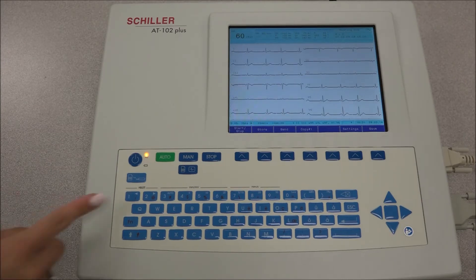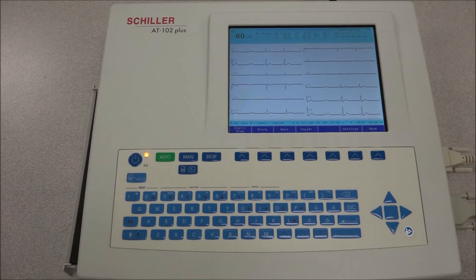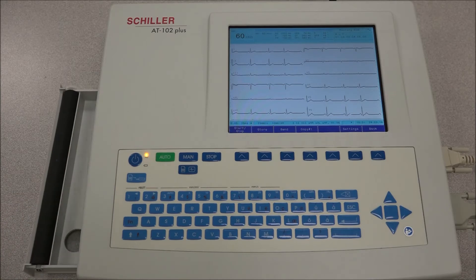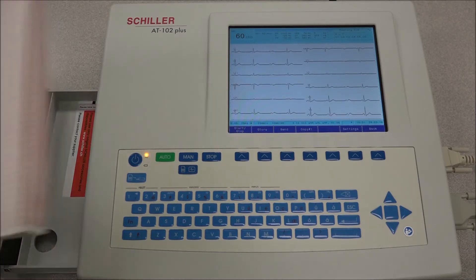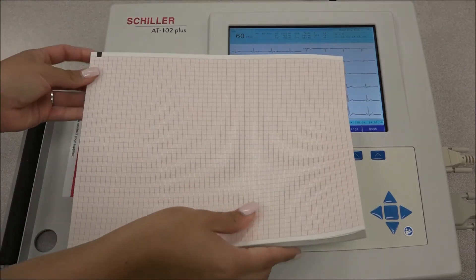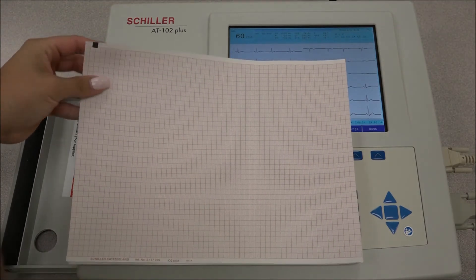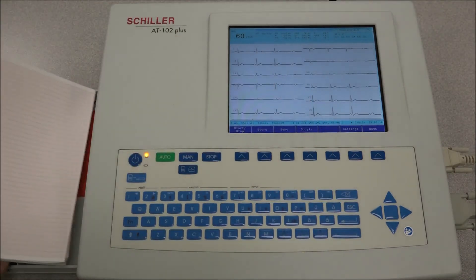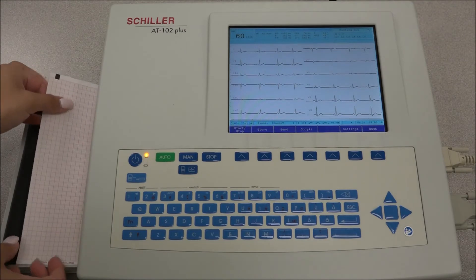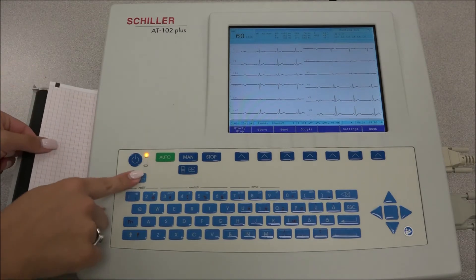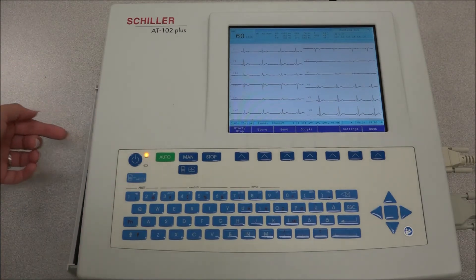To replace the paper, press the REPLACE PAPER key and the paper tray will extend. Insert the thermal paper with the printed side facing up and the black mark at the top of the unit. Press the REPLACE PAPER key to return the paper tray to position, and press the STOP key to transport the paper to its starting position.